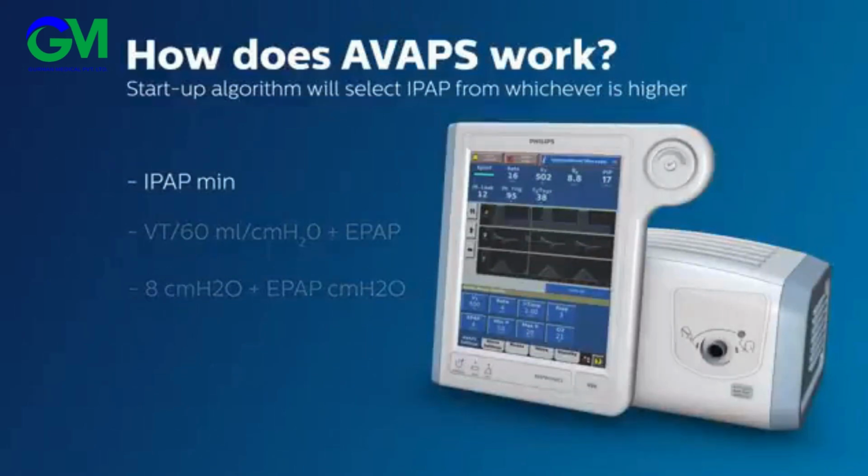So sometimes out of these 3 methods, the minimum IPAP will be the highest value and therefore will be the initial IPAP setting. Or maybe this calculation here will produce the highest value out of the 3 choices, and so this value will be the initial IPAP. Or maybe this calculation here produces the highest value, and therefore it will be the initial IPAP setting. The good news is that you do not have to calculate and determine the higher value. AVAPS automatically selects the highest one of the three and institutes that IPAP as the initial IPAP setting.